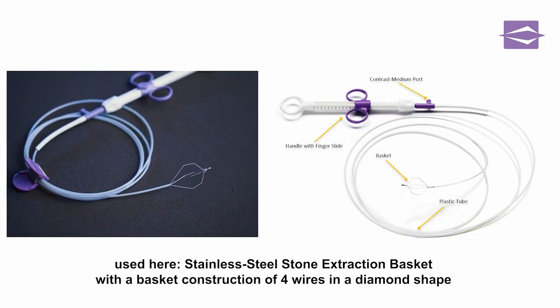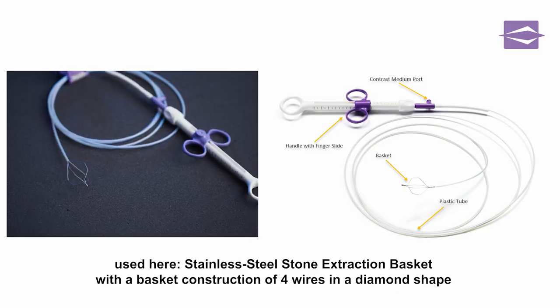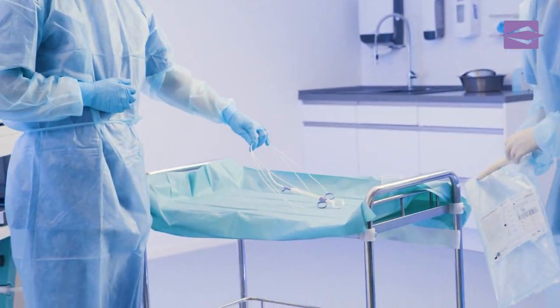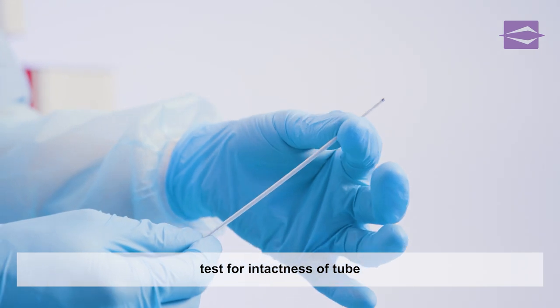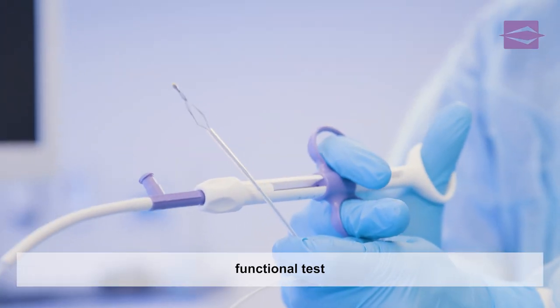we use a stainless steel extraction basket with a basket construction of four wires in a diamond shape. After data comparison, the stone extraction basket is removed from the sterile packaging. The assistant examines the tube for potential damage and kinks. The following function test confirms the usability of the basket.